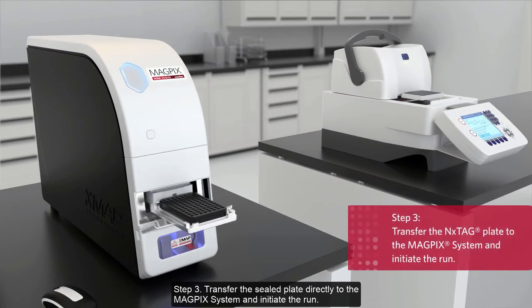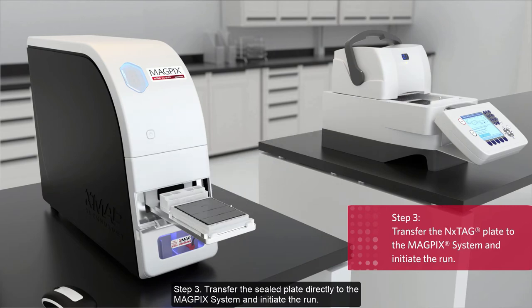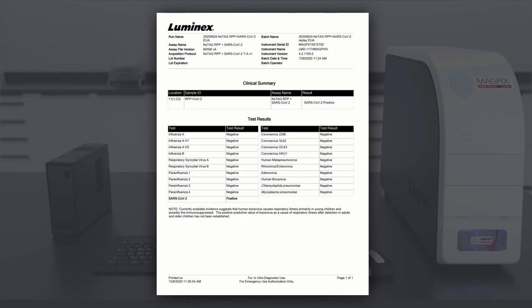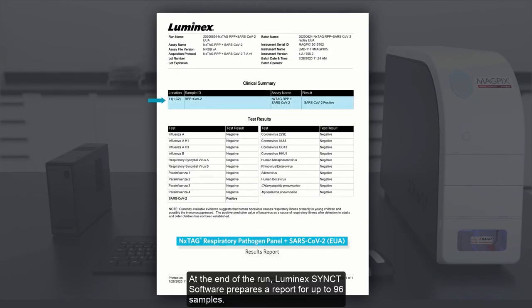Step 3: Transfer the sealed plate directly to the MagPix system and initiate the run. At the end of the run, Luminex SYNCT Software prepares a report for up to 96 samples.